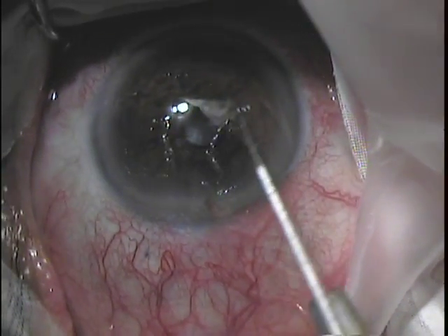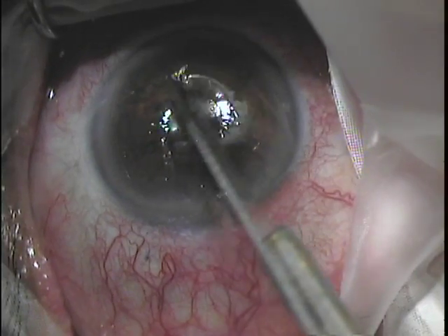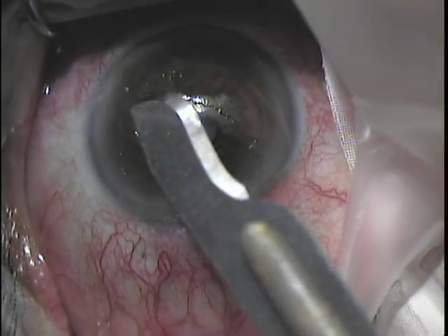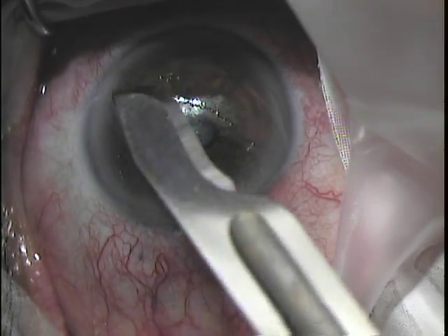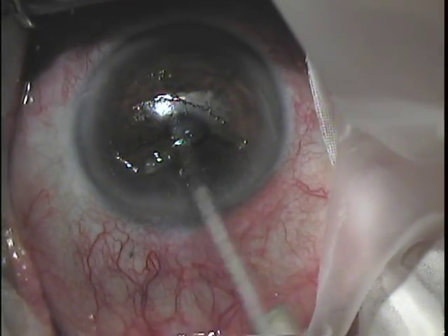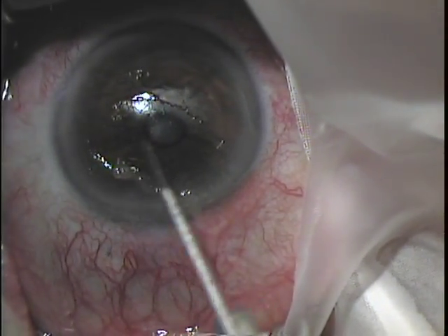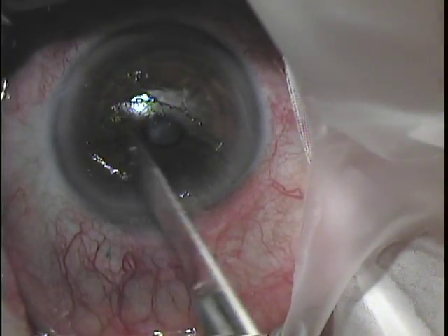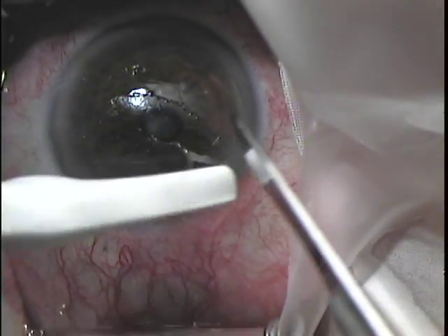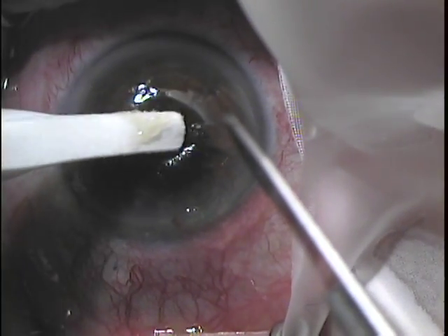In this step, we're using the side of a 15 blade to slightly roughen the edges and do slight debriding of epithelium surrounding the non-healing defect in this eye. We want to leave the corneal surface a little bit dry to allow the best adherence of amniotic membrane and remove all the excess epithelium.